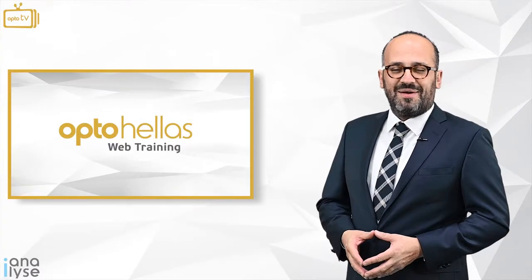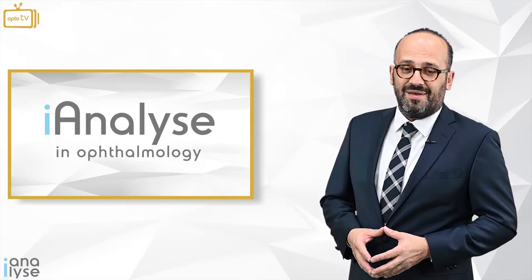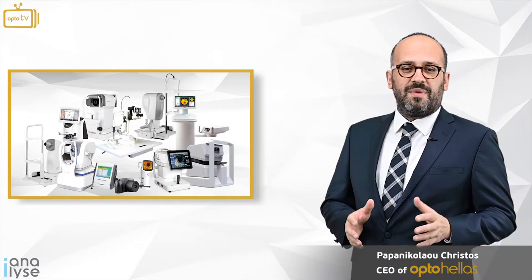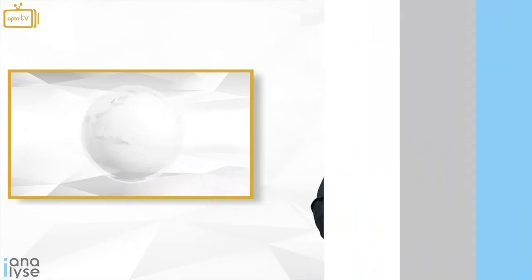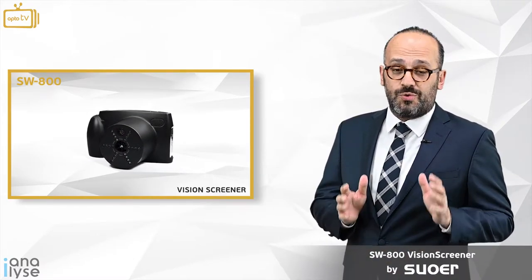Hello, welcome to OptoHela's web training — Eye Analyze in Ophthalmic Instruments. My name is Cristobal Van Nicolaou and I will analyze together with you all the ophthalmic instruments which are manufactured all over the world. Today we are going to analyze the SW800 vision screener by Sower.